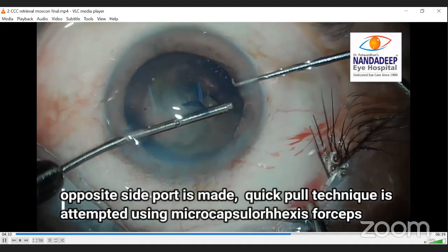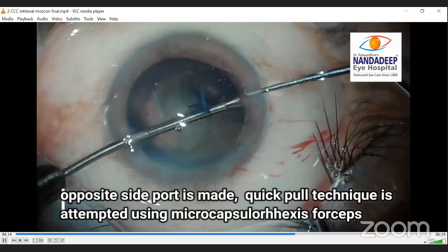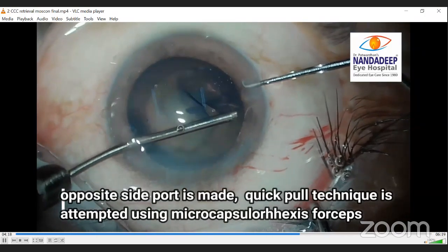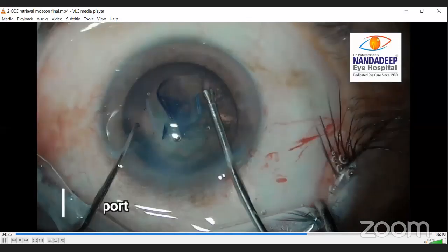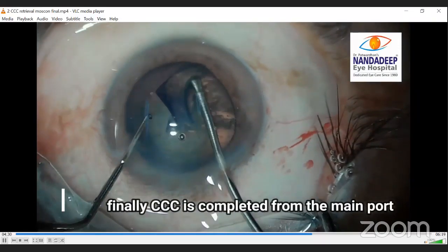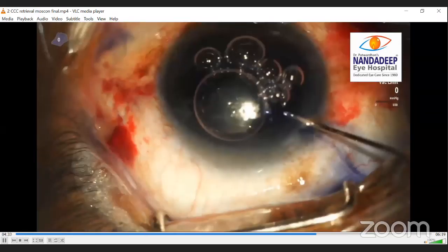Now I am using small microcapsulorhexis forceps, holding the flap from the other side, trying to unfold the flap completely, and now pull it quickly. So you can see the rexis is now coming back. Now I'm going from the main incision again and pulling it quickly so the rexis comes back.